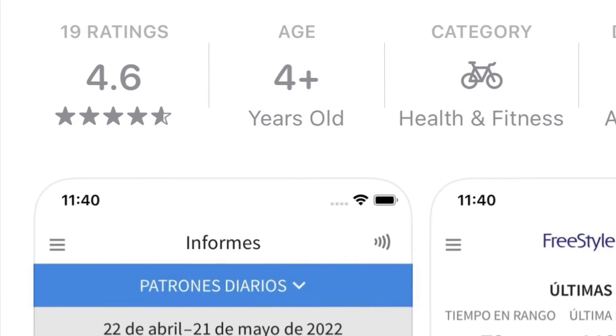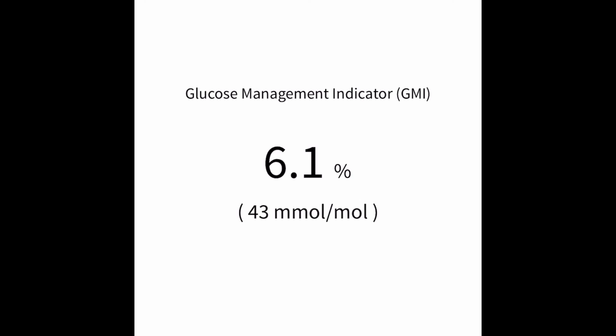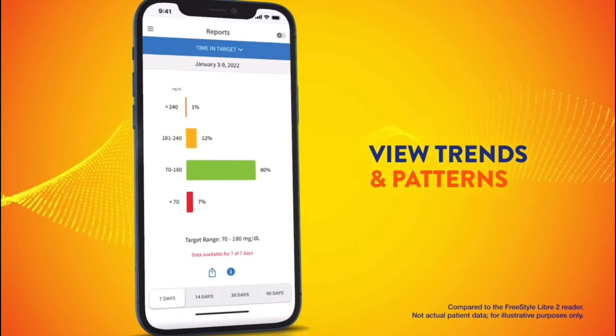What about the app? Is there anything different with the Freestyle Libre 3 app compared to the Libre 2 app? You do have to download a new app for this sensor. I was hoping for some changes, but I found it was pretty much unchanged from the Libre 2 app. One difference I noticed is a GMI button that gives you a calculation of your estimated A1C — a nice feature — but outside of that the app is largely the same. That's good because the Libre 2 app was a solid app with a lot of data, blood sugar trends, and graphs, but there are things that still needed to be updated.